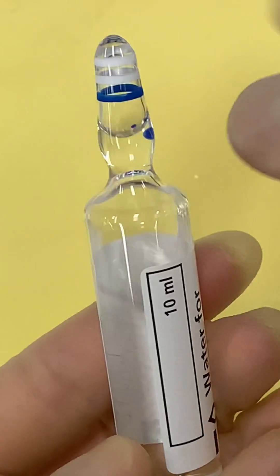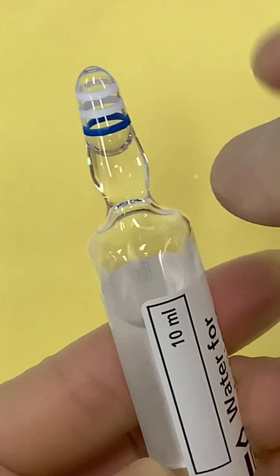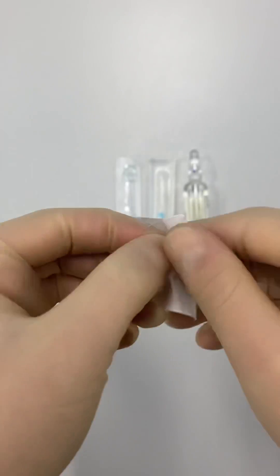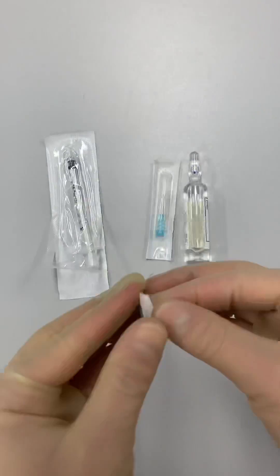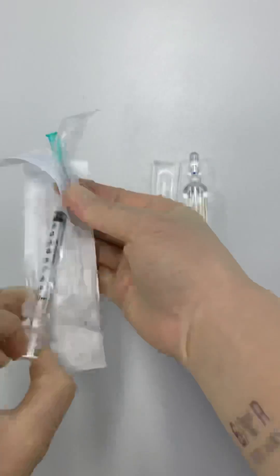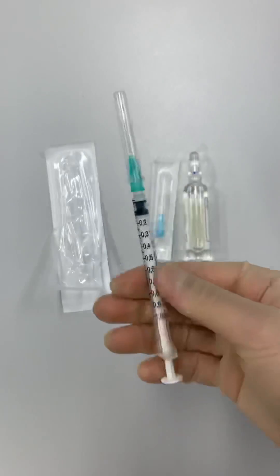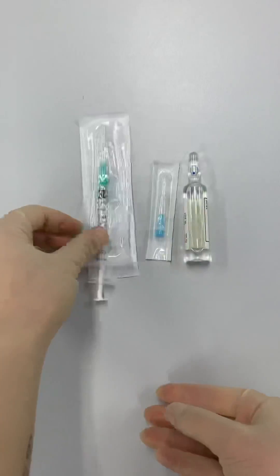Some medications come in glass ampoules and we need to break the ampoule to get the medicine out. But first we need to open the syringe and filter needle and attach them in sterile fashion. The filter needle will prevent any tiny pieces of glass from entering the syringe.